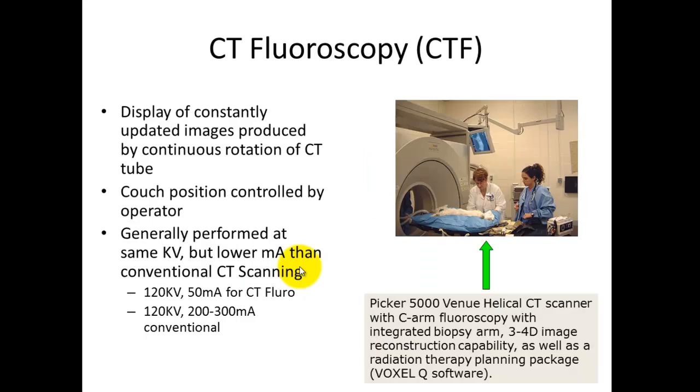CT fluoro, as mentioned. It looks like they're working on a cat or a dog over here. Here's our monitor that can be utilized during the scan. Of course, we have to be careful if you are the fluoroscopist, and you must make sure that your hands, for example, stay out of the beam.